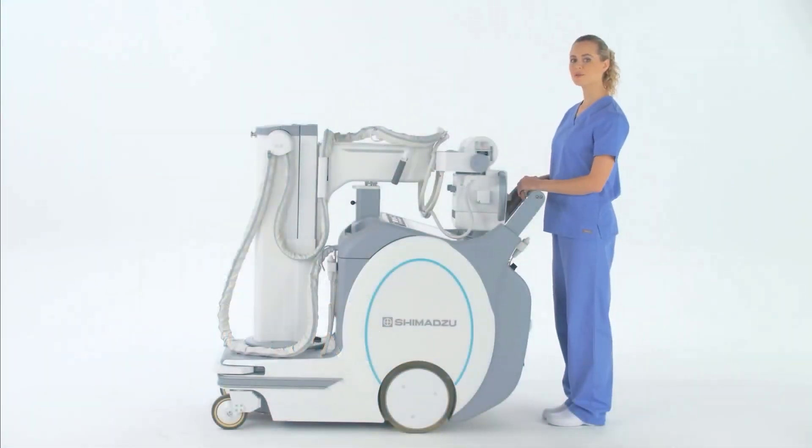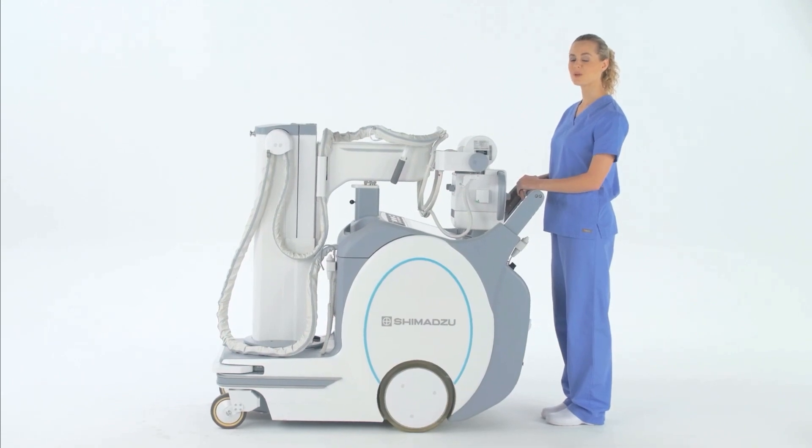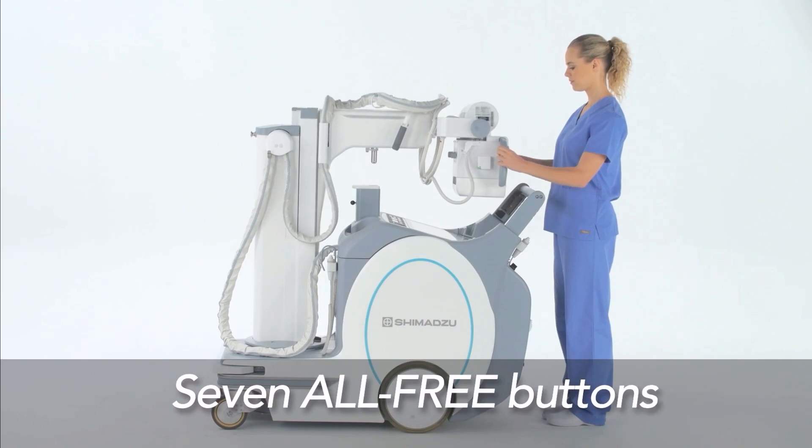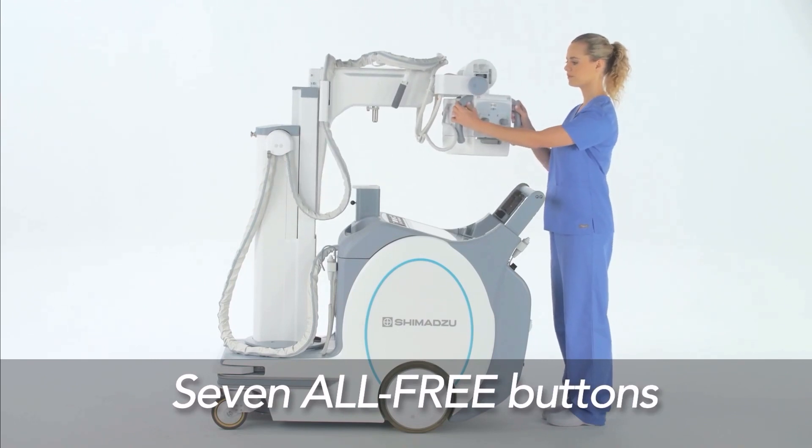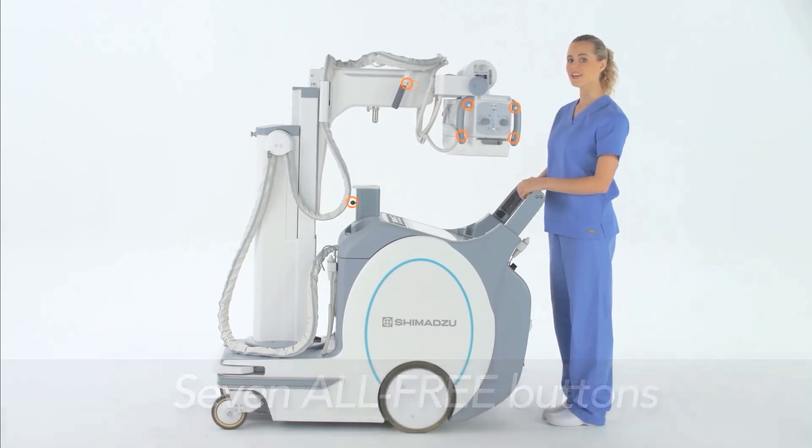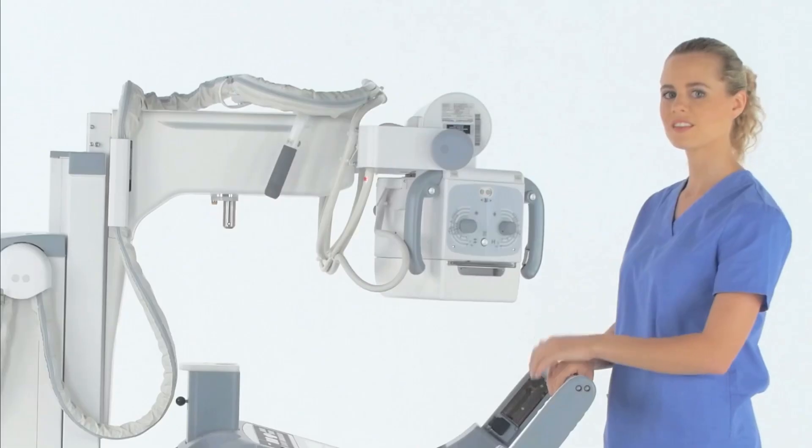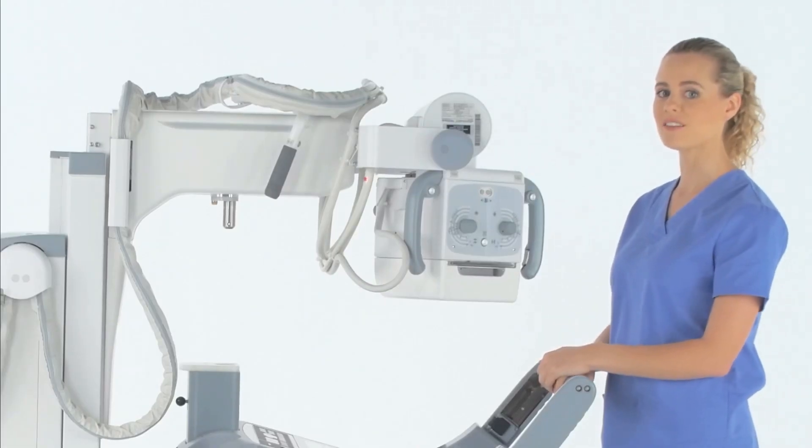When you're ready to use and position the X-ray tube unit, press any one of the seven all-free buttons. They are located at the top and the grip of the handles to either side of the collimator, and on the handlebars on either side of the arms.